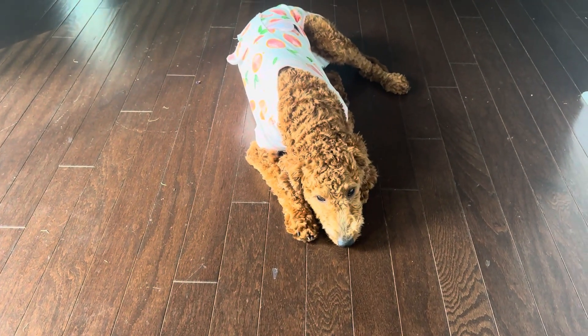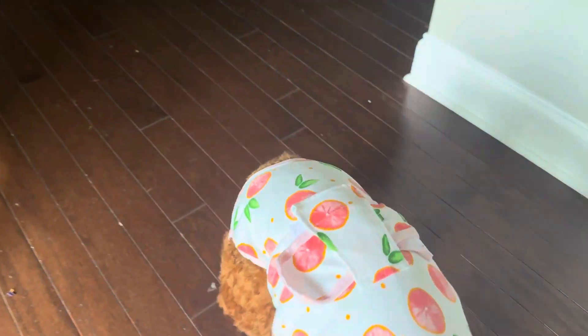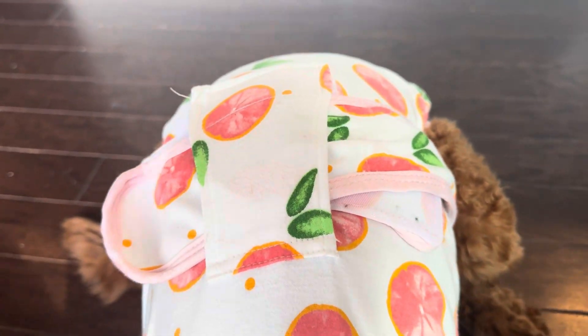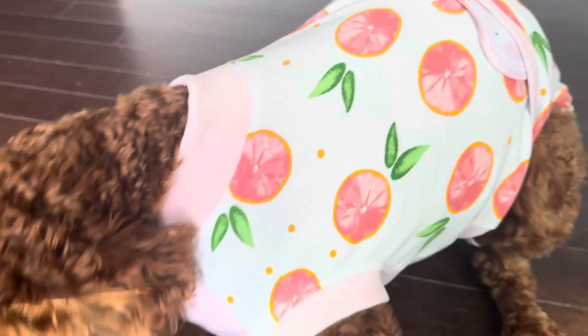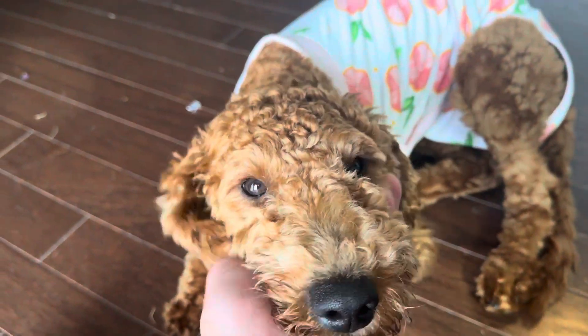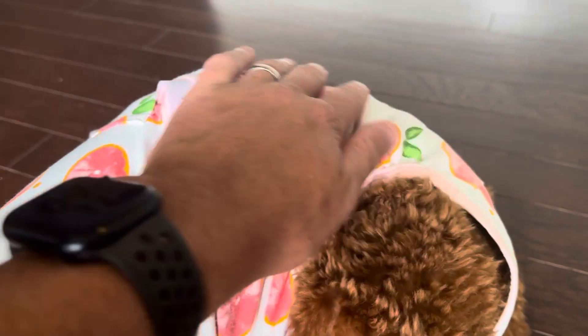Hey guys, it's review time and I got a supermodel here. This is Miss Darla. She's showing off her little outfit that she gets because she just had surgery. This is her post-recovery outfit. Come here, sit. She had the cone on for the first day and it just wasn't working for her.